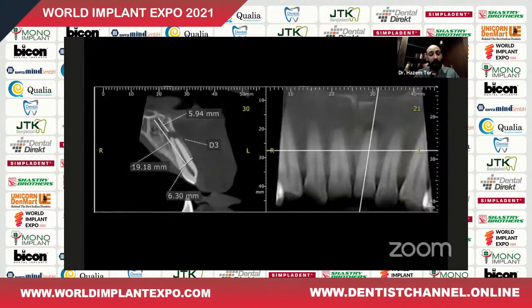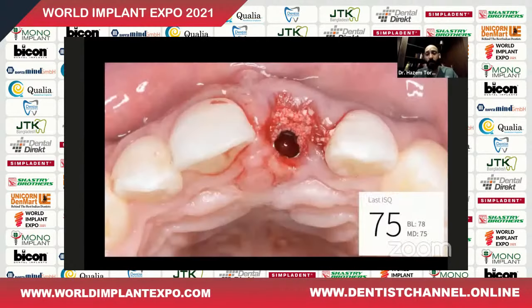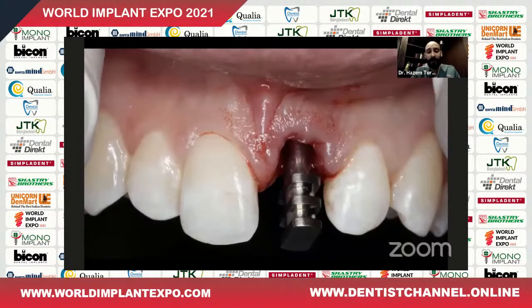Now, as we can see from the X-ray, we have good apical bone and good palatal bone for immediate implant placement and to achieve primary stability. What we did was extract the tooth and fill the gap with xenograft material. Now, you see this tissue, there are two factors that will help you provide support for this buccal tissue until the new buccal plate formation: the particulate bone that we placed, which is not very effective but it helps, and the temporary crown. In this case, we had no access to digital technology, which would have made this a lot easier.